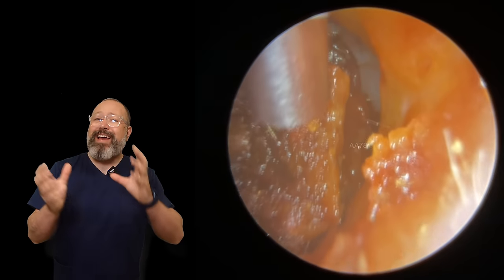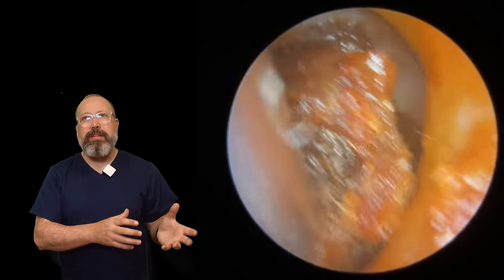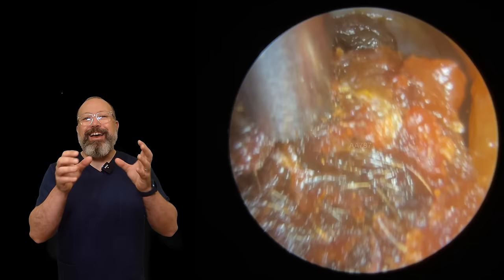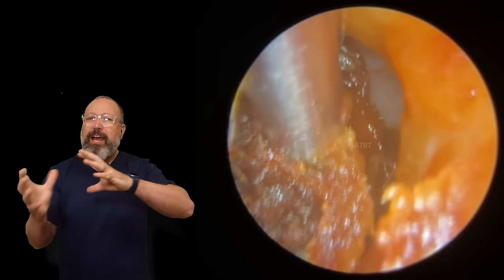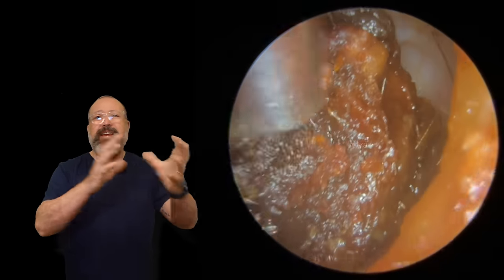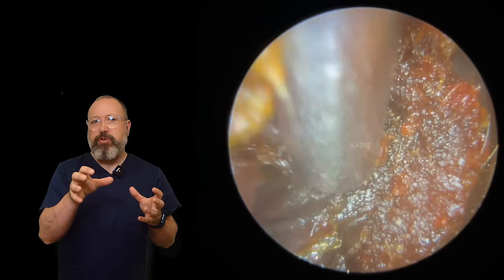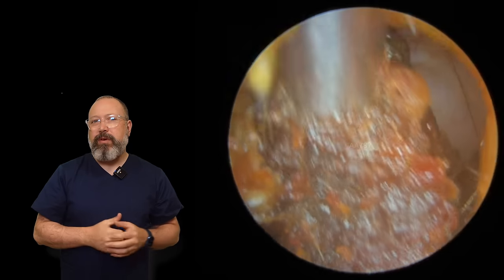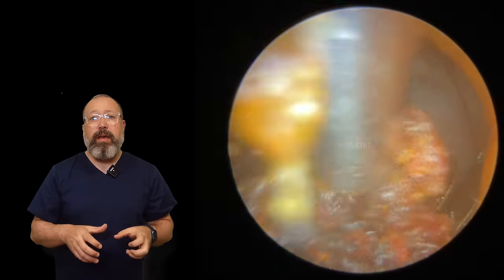What we're trying to do here is detach it from the canal wall. This is a slightly softer consistency of wax — Wednesday's video had very hard plugs of wax. This is a lot softer. As we try to detach it by moving it from one side of the canal wall to the other, it's just bending rather than detaching. That dry strip of skin is binding the plug of wax right down on top of the skin.